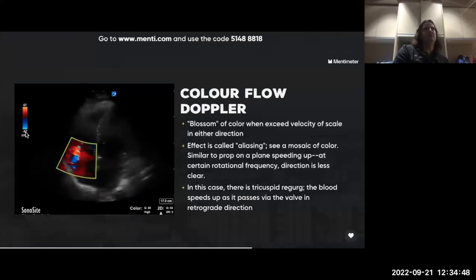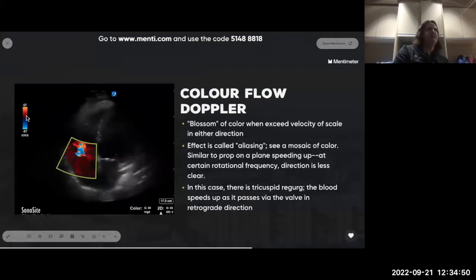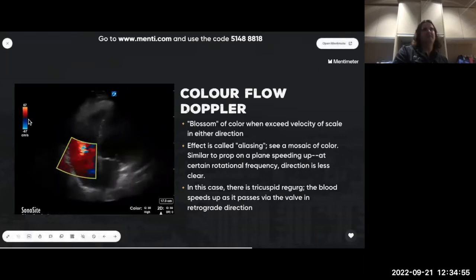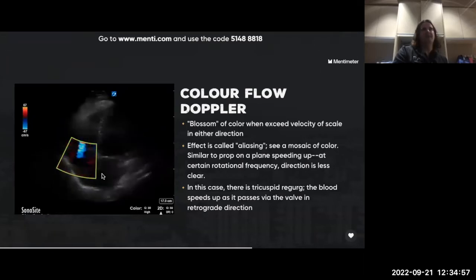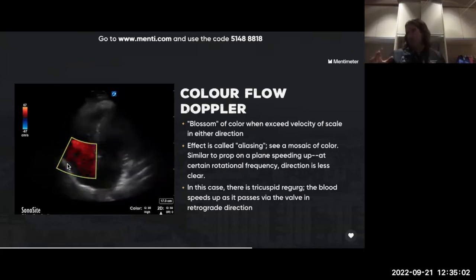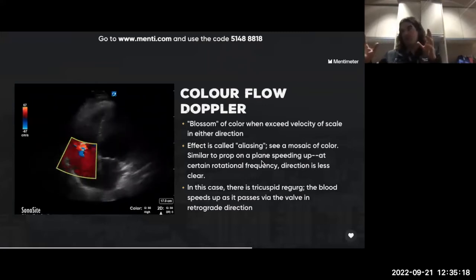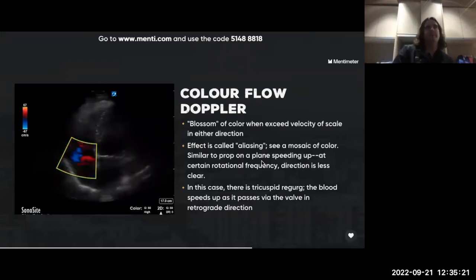So for example, if you reduce this, let's say it's +10 to -10, what do you think would happen? If you changed that on the same heart. It'd be very, very bright, right? Like a big signal, even bigger. Well, it may become even more pronounced, but may also become very noisy, as I think you're intuiting, that all of a sudden the signal is much brighter and much bigger and hard to separate. Yeah.